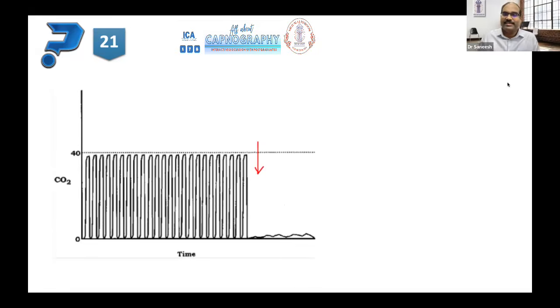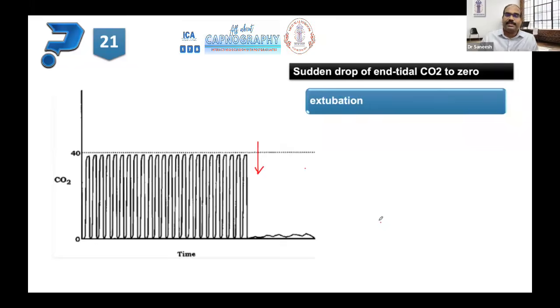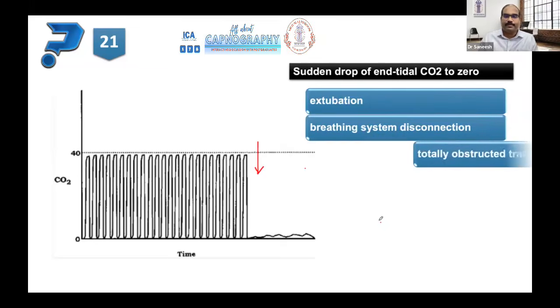Okay, quickly, somebody summarize this. Yeah, Dr. Prajwal. Sudden hypotension, sir, or embolus. Suddenly dropping to non-zero values, a shock. Cardiac arrest also. It could be a cardiac arrest or pulmonary embolism. So if you know the history and know the trend, you can troubleshoot it better.